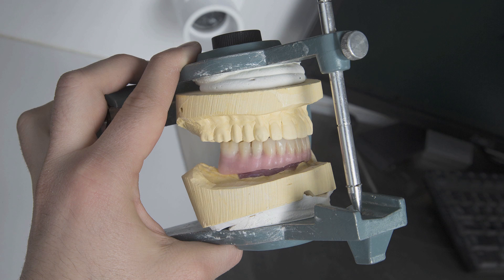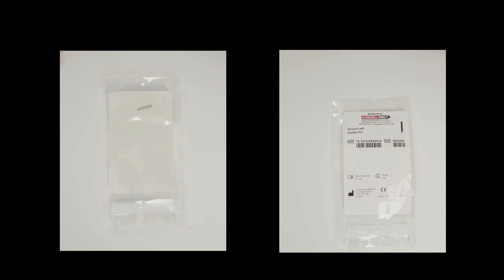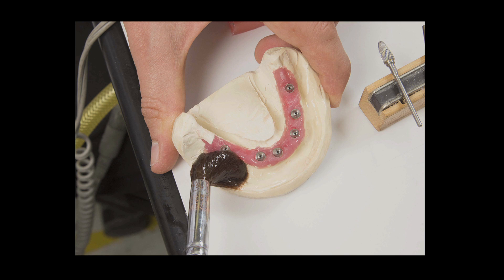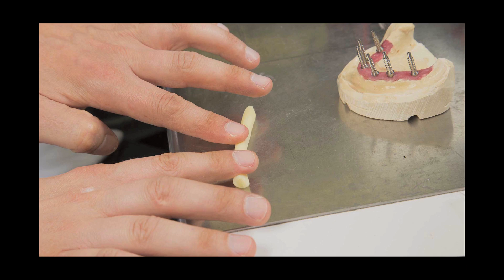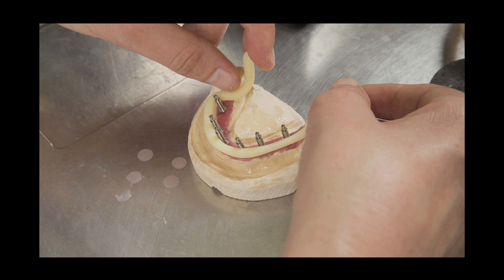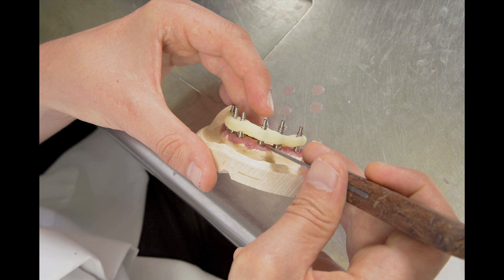Finally, the appliance is placed back onto the articulator and its occlusal relationship to the opposing arch is verified. Next, the lab proceeds with the fabrication of the implant verification jig, which will be used to ensure a passive fit of the final prosthesis. Temporary titanium cylinders and guide pins are selected. Separator is brushed onto the soft tissue model. The titanium cylinders are screwed into the implant analogs or, in cases where they are required, the multi-unit abutments. Light-cure material is rolled out in a thin band, wrapped around the cylinders and pressed together, ensuring that it does not rest on the soft tissue model where it would prevent impression material from flowing under the jig and around each cylinder.